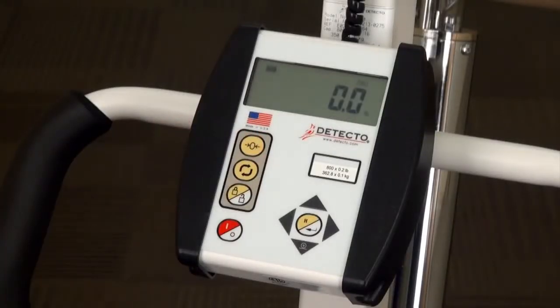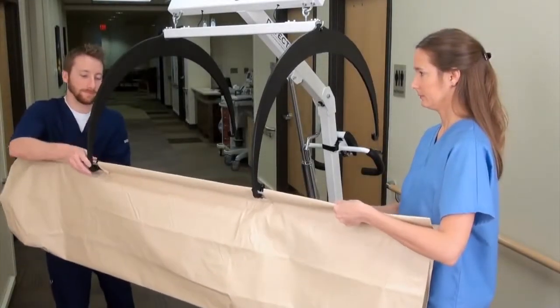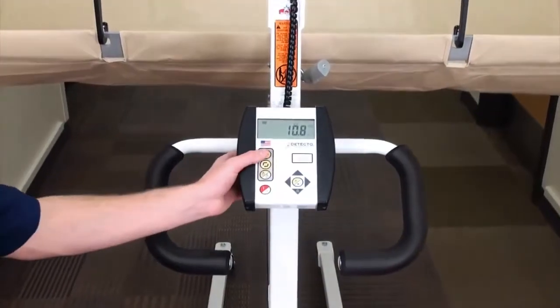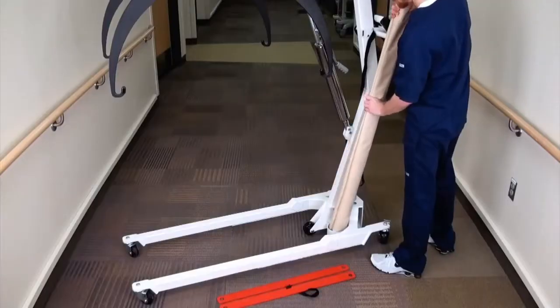Turn on the indicator and press the zero key. Attach the stretcher to the hoops using the support bar holes. Once attached and the stretcher weight is established, press the zero key again. This tares the weight of the stretcher.